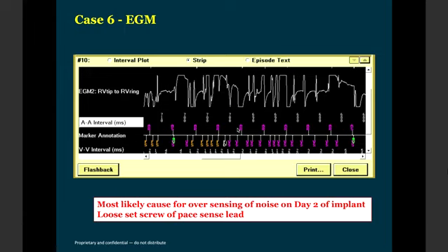So the first one, sir: when should we opt for single chamber or dual chamber, or single coil or dual coil, any criteria? To answer the second question first, the SVC coil does not have any great advantage in today's time. Previously, we had issues with low energy devices and high defibrillation thresholds, where you can actually strain these vectors. You can use both the coils, you can use the CAN, multiple vector combinations are possible. In today's time, with modern devices with high energy capabilities and more stringent detection and therapy criteria, the SVC coil is not a very useful option.